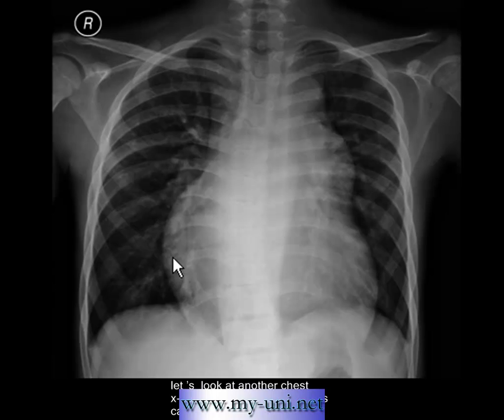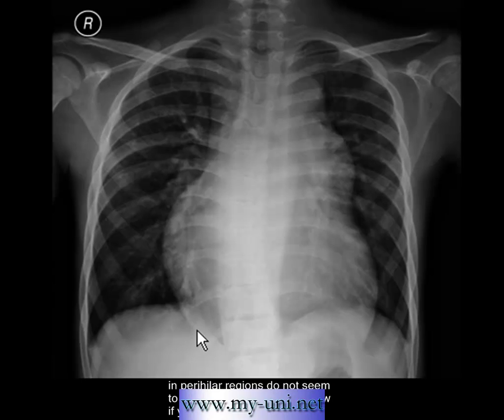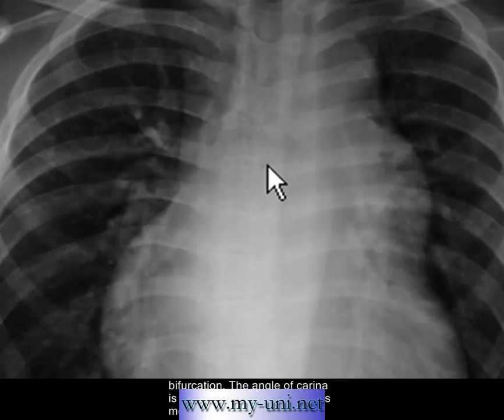Let's look at another chest X-ray. This X-ray clearly shows cardiomegaly. The main and central pulmonary arteries on both sides are dilated — especially the bulge on the left side, which is very convincing. You'll also notice that the visible vessels in the peri-hilar region do not seem to be dilated.